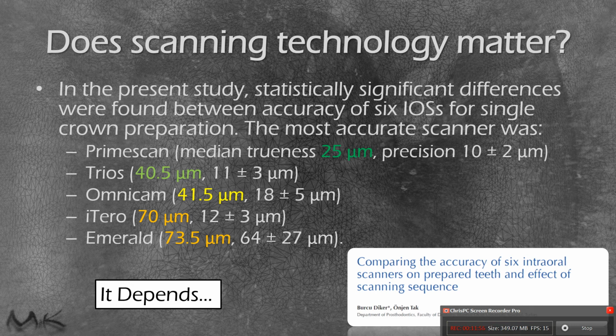But the takeaway point from this is a lot of the newer scanners we have in the market that have been released in the last 3 to 4 years really have an accuracy that meets all of the demands of our fixed prosthodontics, and is starting to get to the point when we see PrimeScan and the new Trio scanners where we can really do this for all full arch laser sintered bars and prosthetics that traditionally had to be done with a pickup type of impression with impression copings that were put together with Duralay pattern resin.